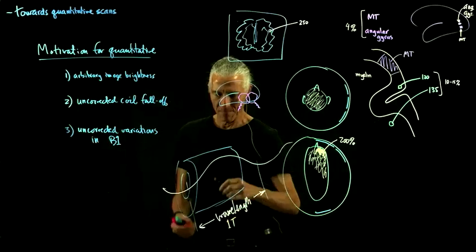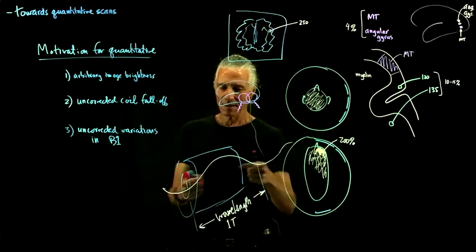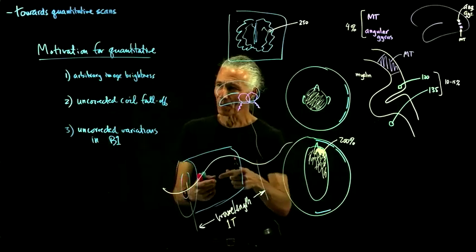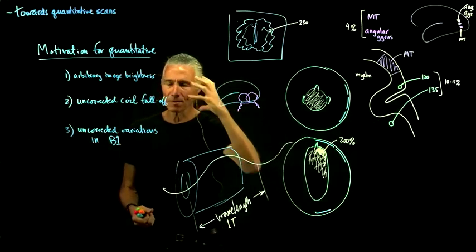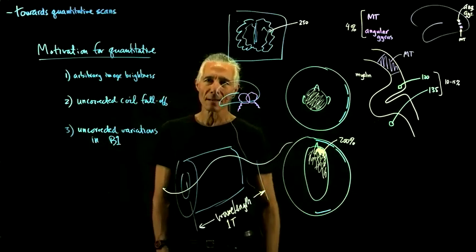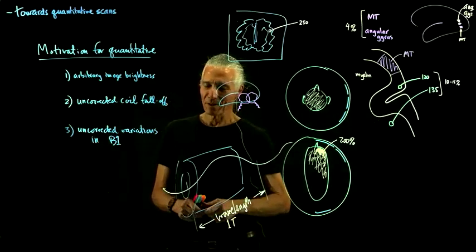At 3 Tesla, it's going to be 1/3 the wavelength, and so it's going to start to resonate around inside the cavity of your head. At 7 Tesla, it's worse. So at 7 Tesla, this is a story I always tell.